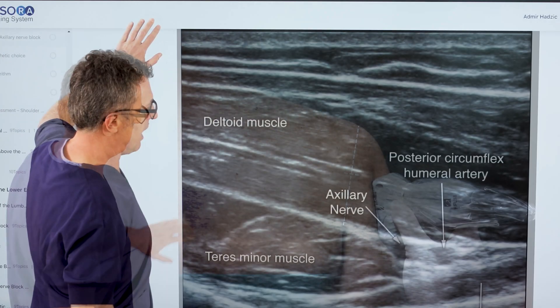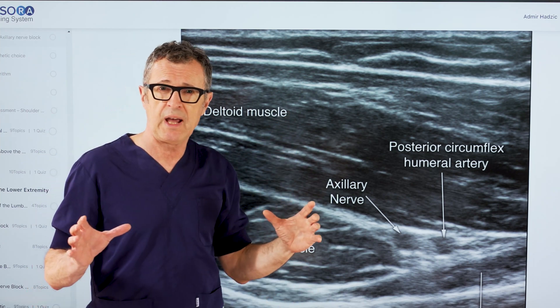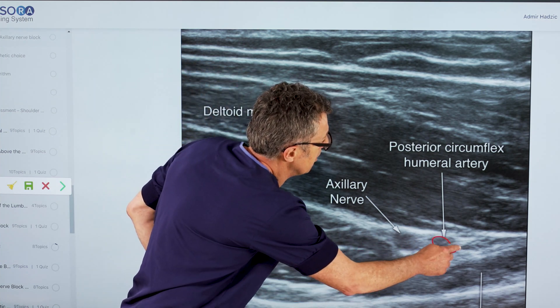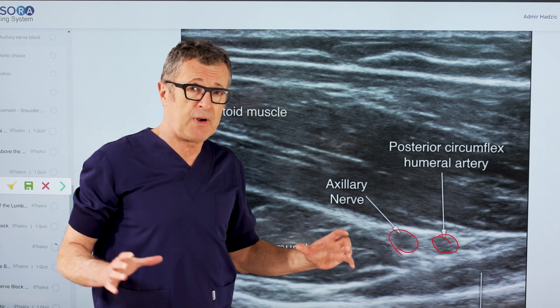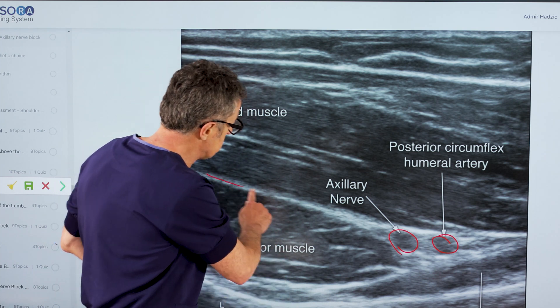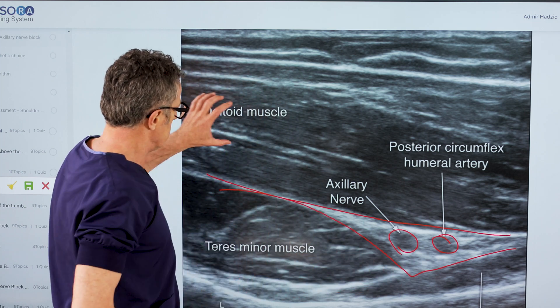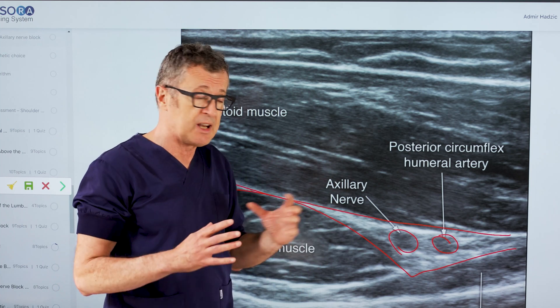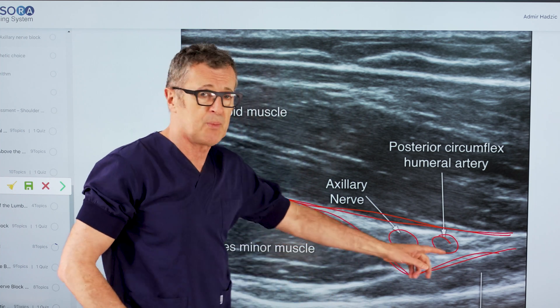Now, this is the ultrasound image that corresponds to that transducer position. Here you can see this is the posterior circumflex humeral artery, and that is the axillary nerve. Very important to understand is that these structures are actually nested into the fascia layer, and that fascia layer belongs to the deltoid muscle and teres minor muscle. These two muscles invest fascia that splits to encompass the axillary nerve and its accompanying artery.